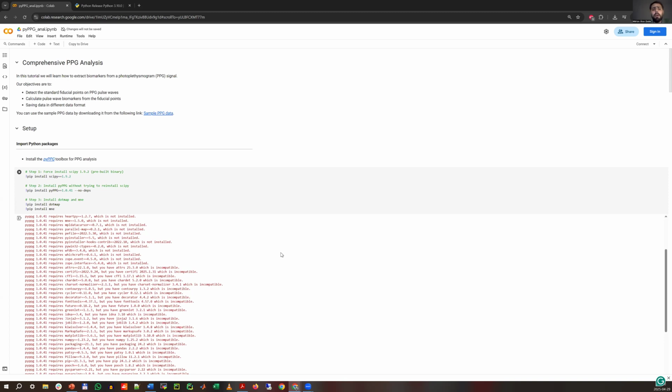And the fifth part of this module is the biomarker statistics, which means that we summarize according to 9 statistical parameters, statistical metrics or biomarkers. We make a signal quality assessment after that, and we can easily save the data.